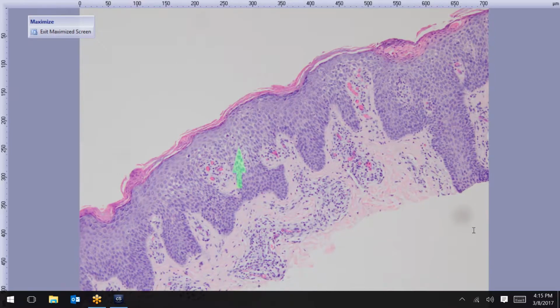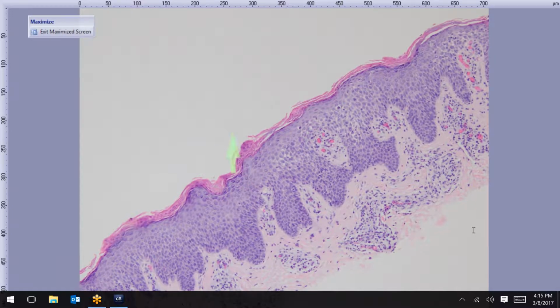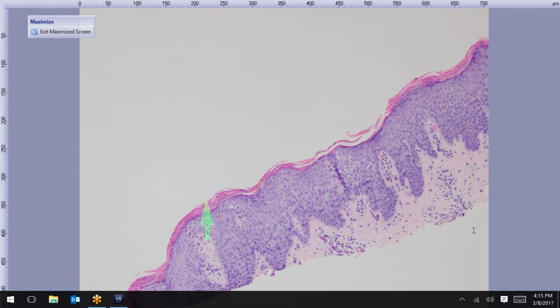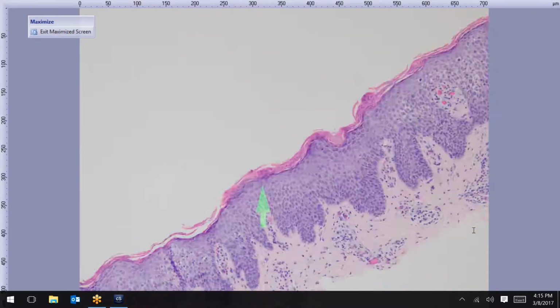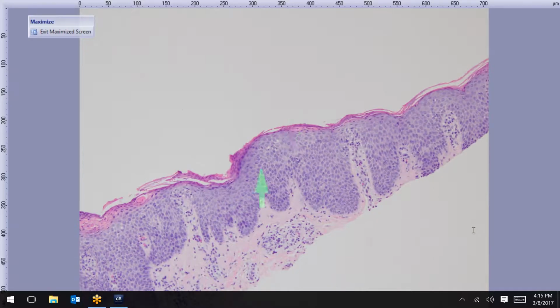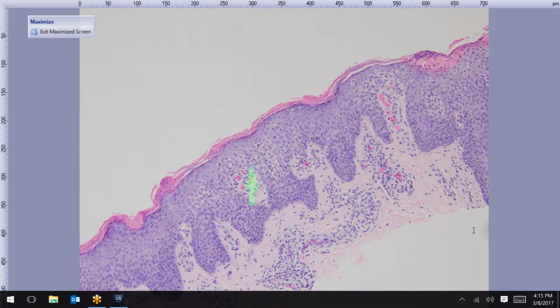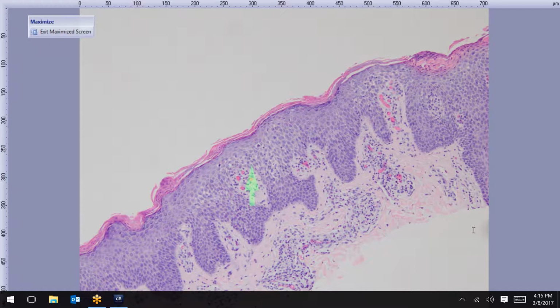I would say that on top of that, you see these parakeratotic areas here. And yeah, that's correct, this is the mounding of parakeratosis. Here's a mound. Here's another mound. So you have multiple mounds of parakeratosis with spongiosis. And I would say in pityriasis rosea, which this is, the term I use is muted spongiosis. So you don't often get to frank vesicles. It's just a mild spongiosis that's evenly distributed throughout much of the epidermis.